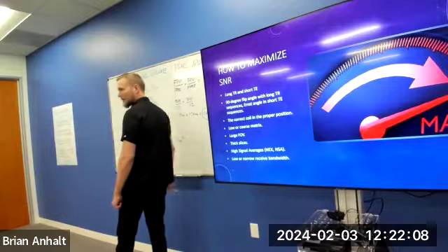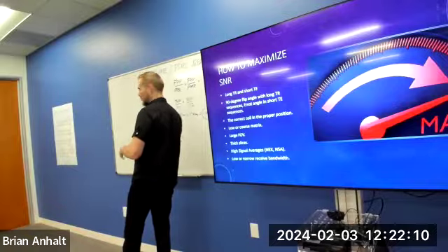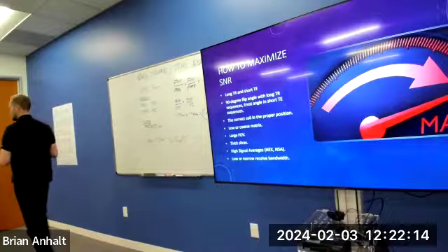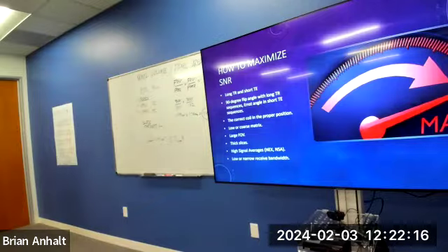We have square here multiplied by another. Now we have little cubes that are that size. 8.7 millimeters squared, or cubed, sorry. And that is your voxel volume. So you will be asked to answer questions like this. If I give you those numbers, you should be able to figure it out.